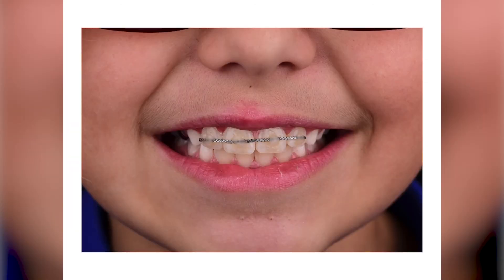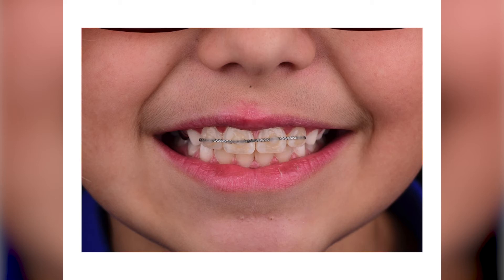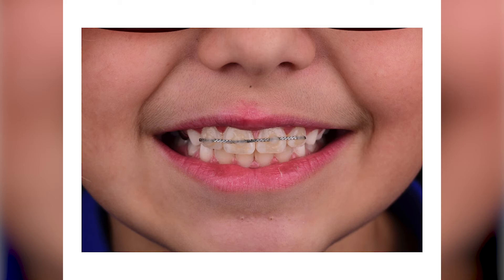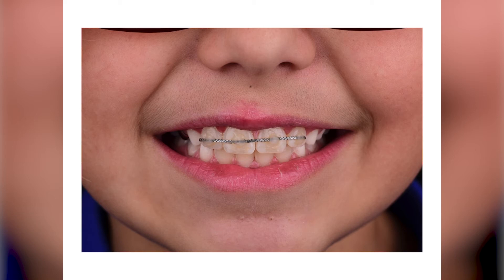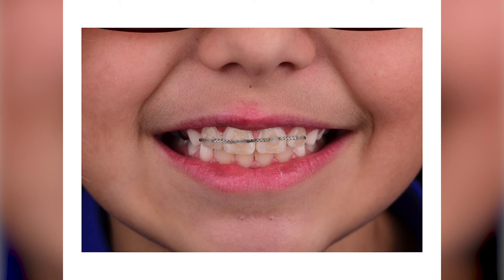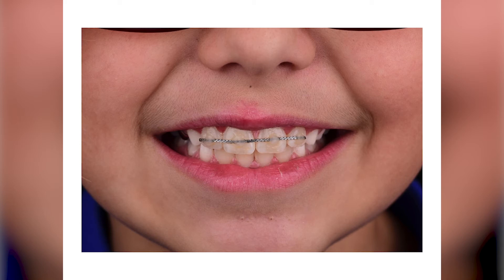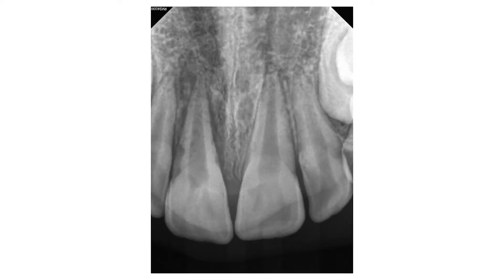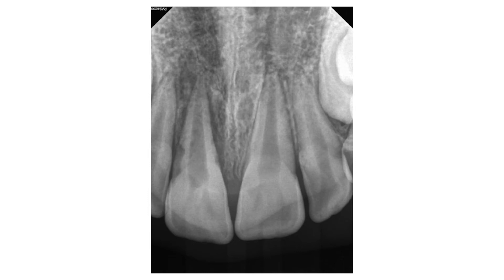The patient returned and endodontic evaluation was performed. The tooth did not respond to cold, and was referred for root canal therapy. As you can see, the tooth and splint are in position, and the soft tissue still has slight inflammation around the area. The periapical image shows signs of inflammatory root resorption.